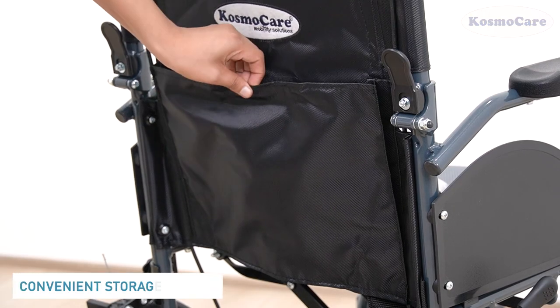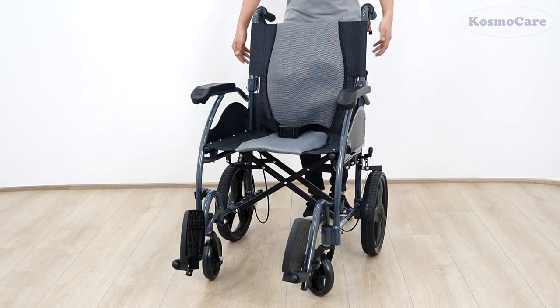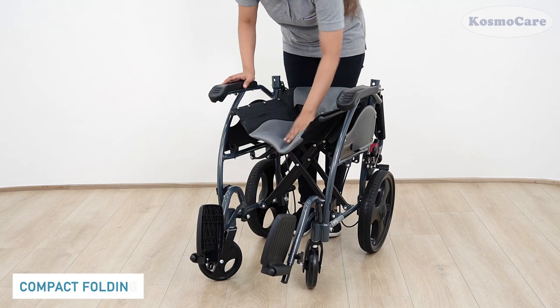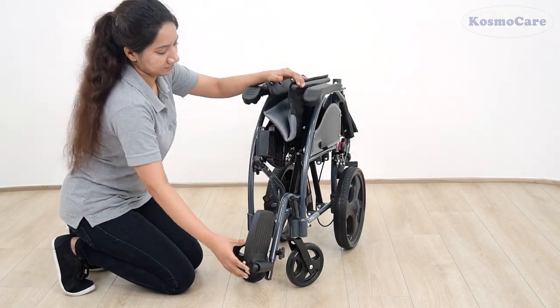Store your essentials in the back storage pocket provided, while keeping your hands free. Folding the chair for transportation or storage is a breeze. Simply pull both the drop-back levers simultaneously to fold down the back support, and then pull the seat up to collapse the frame, flip up the footrest to fold the wheelchair.